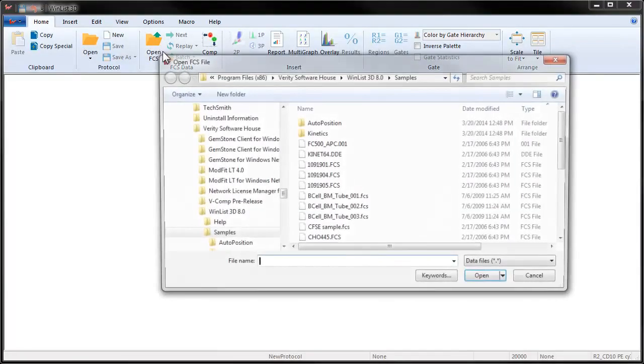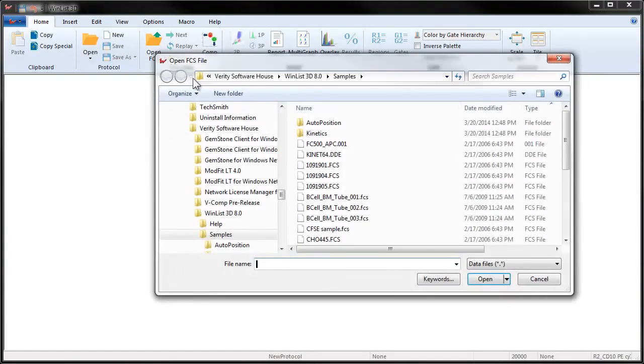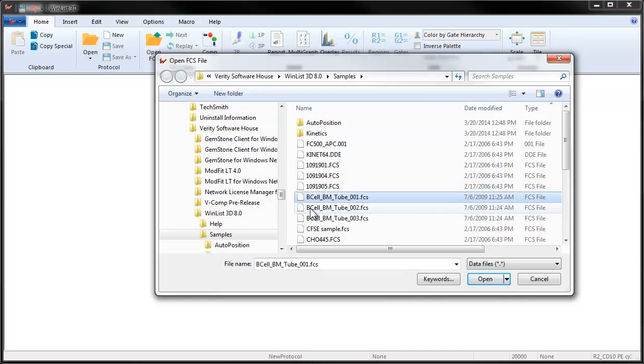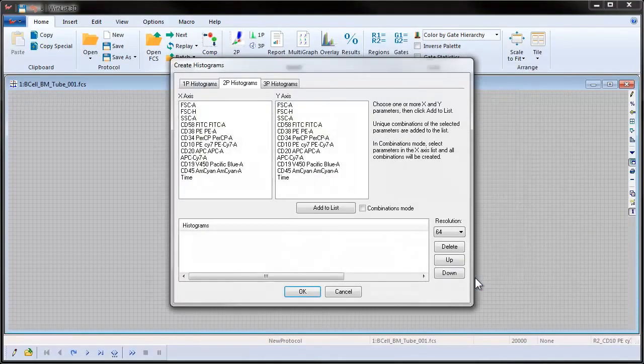Click the Open FCS File button on the ribbon bar. In the File Open dialog, navigate to and select the three sample bone marrow files and then click Open.